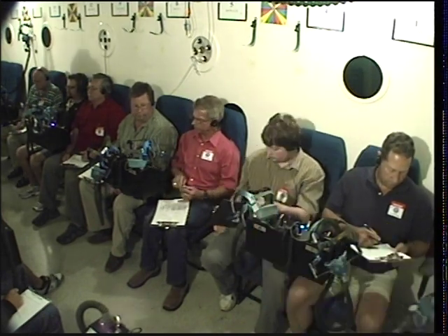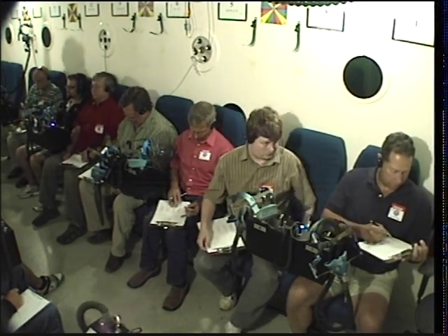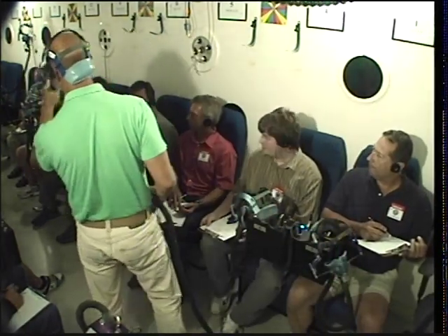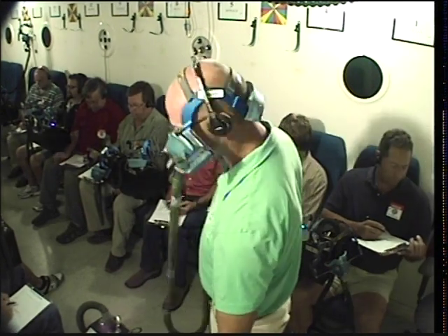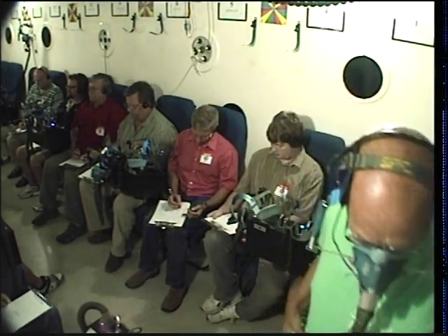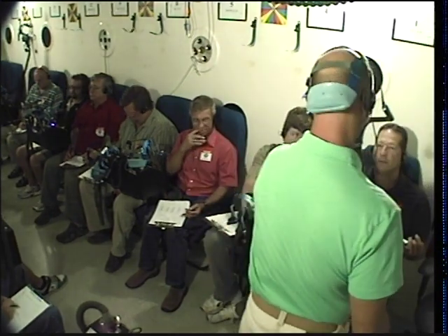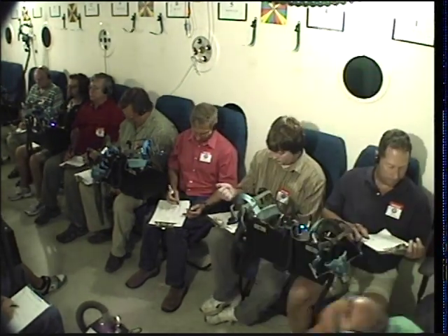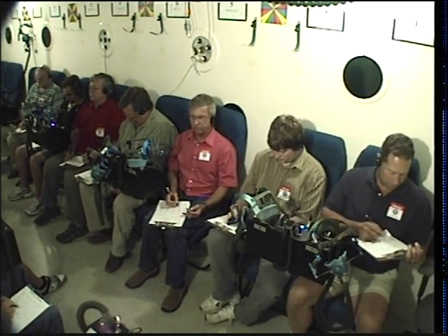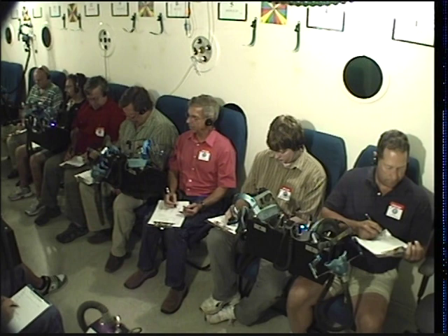Very good. This is a dexterity test. Dropped your pencil. Does he need oxygen already, JR? Yeah, there might be one in the cabinet right here, JR. No? Okay, guys. Brian's side, you're looking for any symptoms of hypoxia that were not apparent before you took that mask off. And what our objective is, 3 good symptoms. Once you get 3 good symptoms, you need to make the determination to find your mask, don it, check your regulator, and control your rate and depth of breathing.